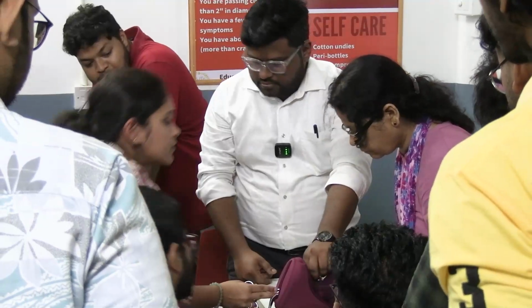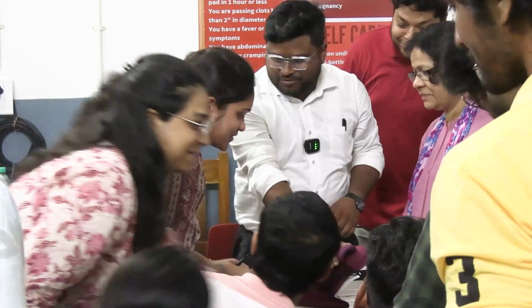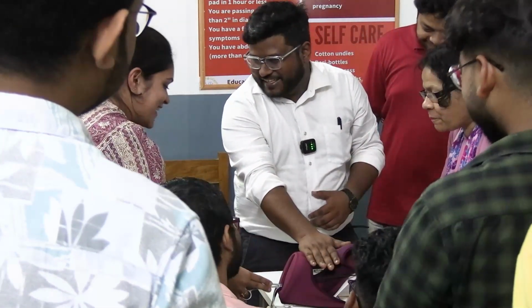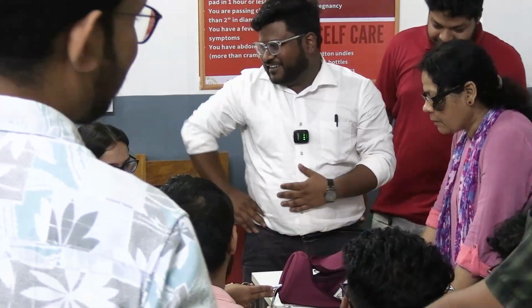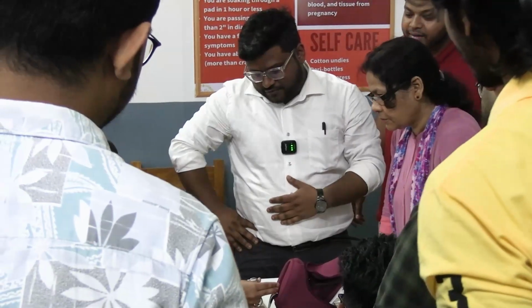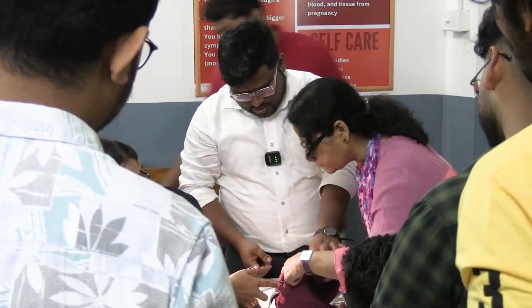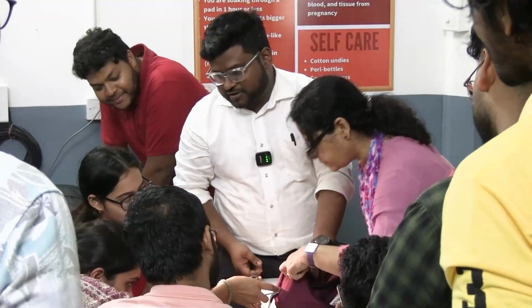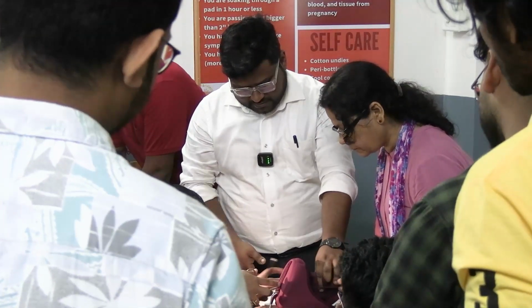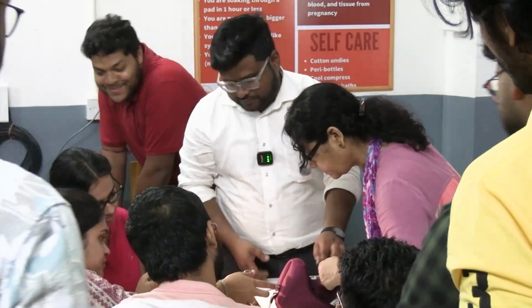Can you see the lip? There's nothing here, just the abdomen, nothing is visible. Have you held it? Catch the anterior lip of the cervix. You're in the fornix, somewhere in the anterior fornix. You have to hold this part. You're puncturing the front.